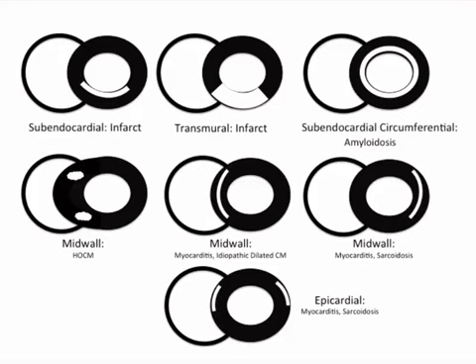That's what cardiac imagers will say. Basically, you're looking for scar in the cardiac wall that's going to enhance on delayed imaging. The normal myocardium will enhance early on, but it will wash out. And there are different patterns based on different disease processes. I'm going to go through and talk about this. You're going to see this diagram a couple of times in this lecture.